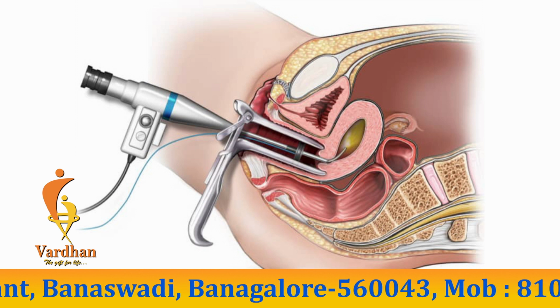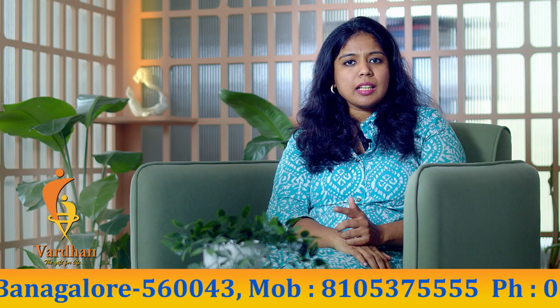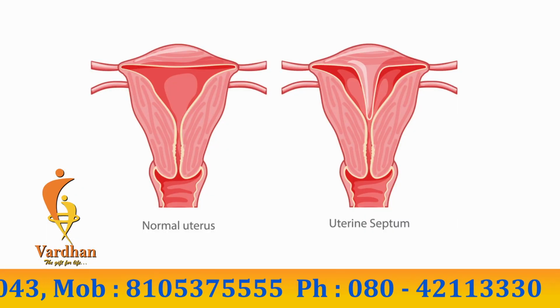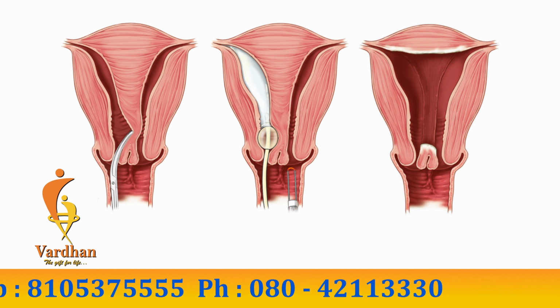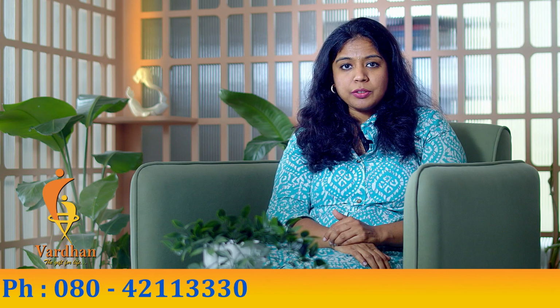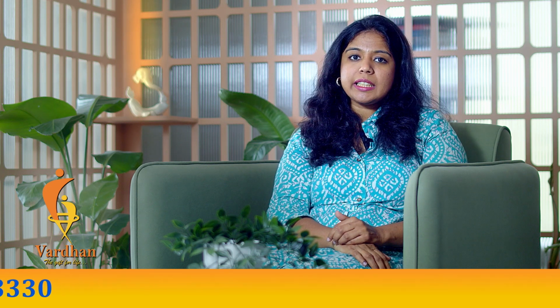Next, it is also done in patients who are suffering from recurrent pregnancy losses, to find out if there is any abnormal shape of the uterus, like a septum or a septate uterus. And it's also done for evaluation of patients who are having recurrent implantation failures when they are undergoing infertility treatment.